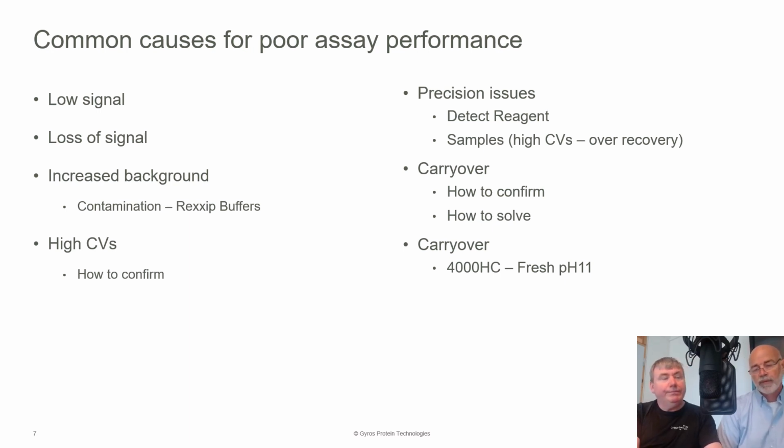I'll often talk about a two-step process for dealing with carryover. One is to use the right diluent, and then make sure you're using a stringent wash solution to clean the needles. It's a two-step process. Some people will do one step, cleaning the needles, but they let the needles get really dirty because they haven't optimized what they're diluting their samples with.